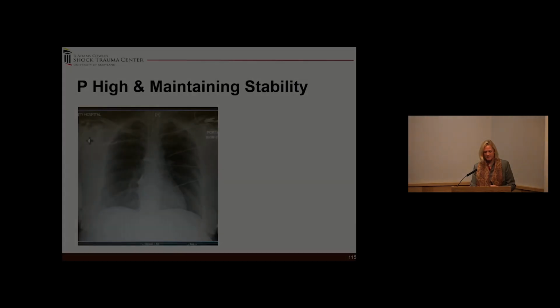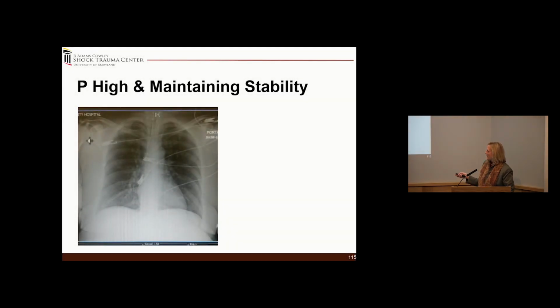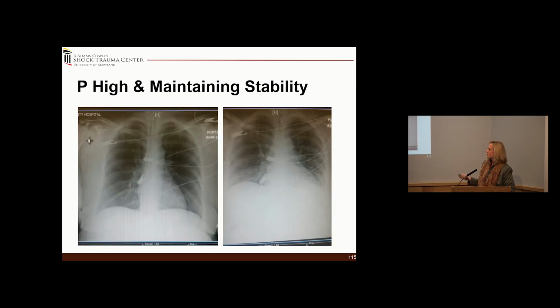And this is an example of a patient that actually was taken off of APRV. Everything looked good. The blood gas looked good. The chest x-ray looked good. This is after 2 hours. Bibasilar collapse. So this was a broken lung. It was not ready to have the cast cut off yet. So that's just one thing to look at. Everything can look beautiful, but just temper your desire to immediately take them off.